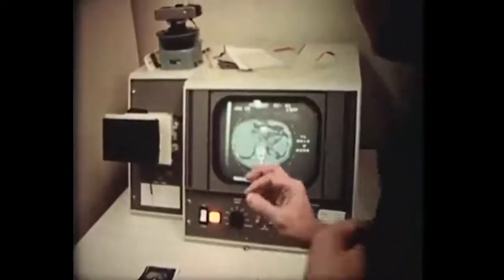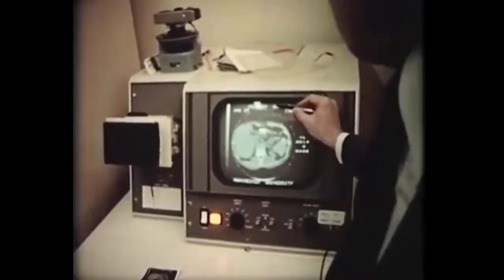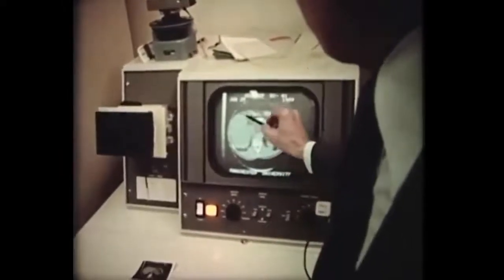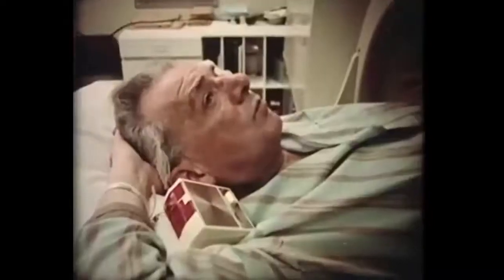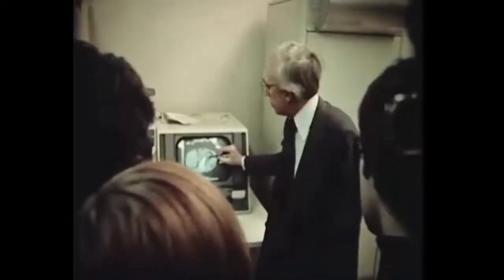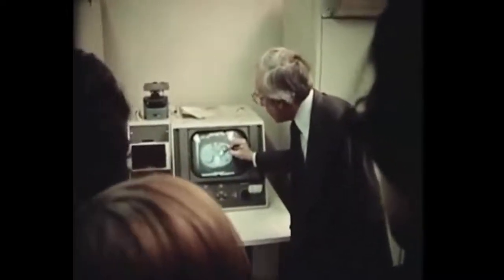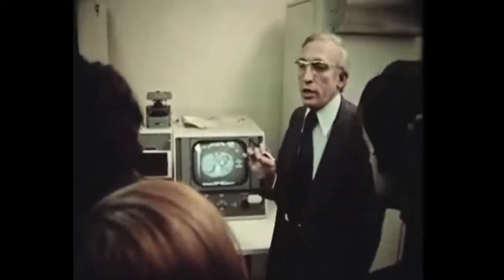Now here we're looking at the first section through Mr. Chadwick. Here's his initials on here. And here's his vertebral body. This is the liver and part of the spleen over here. And we're beginning to get hints here, can you see, of calcification, which we couldn't see on the plain films, in the tail of the pancreas. And if you look carefully there, there's a black ring in that area, which is very like that cyst we were looking at in the other patient, in the head of the pancreas.